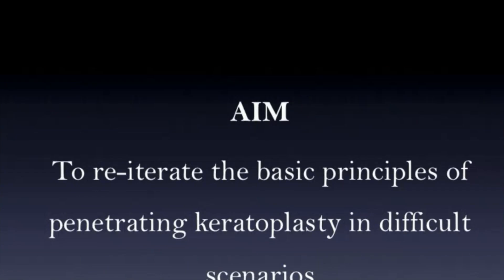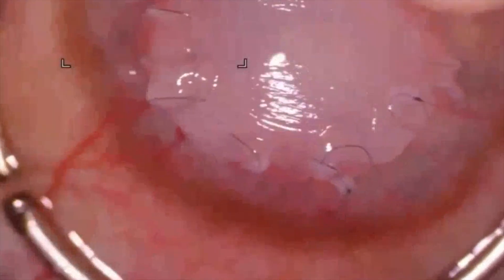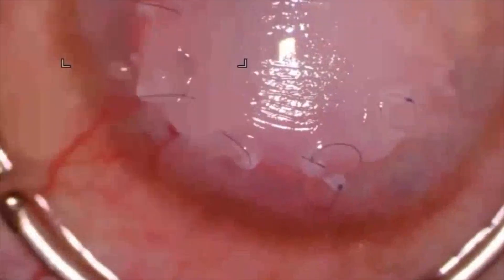The aim of this video is to reiterate the basic principles of penetrating keratoplasty in a difficult situation. Here we present a 25-year-old male who came to us with a history of therapeutic penetrating keratoplasty two months back for active Pythium keratitis. The patient presented with a severely inflamed and necrotic graft as seen in the video.